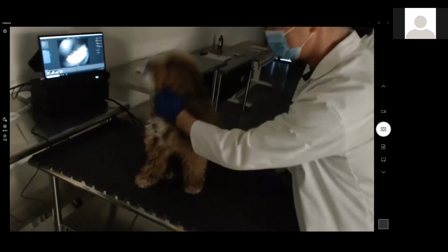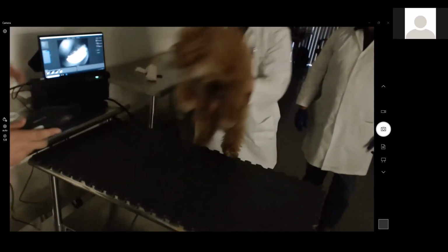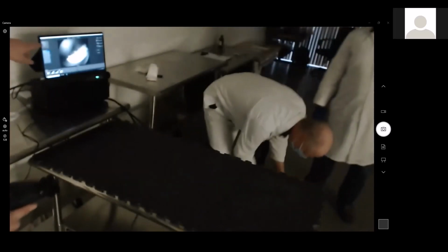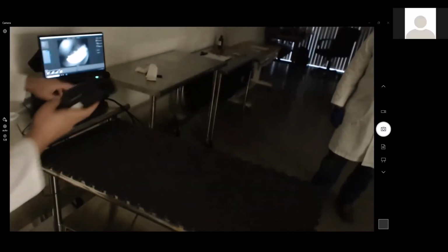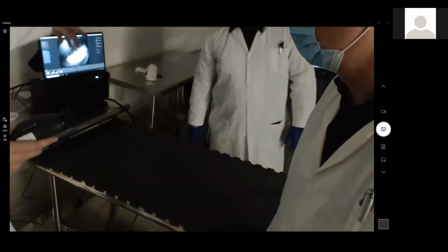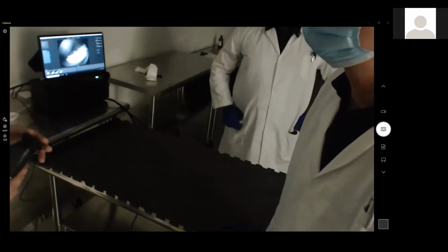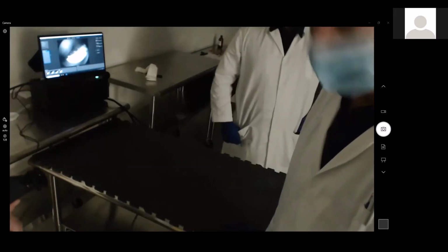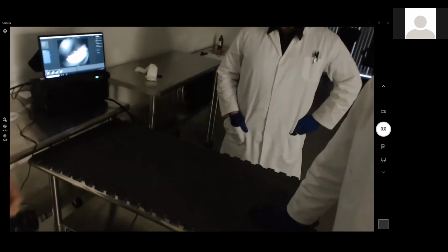And Jillian, absolutely, we agree. The light's a little bright on this, and unfortunately, the only way that this system allows us to make any adjustments is through the internal camera on it. The only thing we're allowed to really adjust is the gain and the gamma, what the camera is actually collecting as opposed to the light source. As you mentioned earlier, with different fundoscopes, we use a separate light source, of course, so we can control how bright that is into the eye.